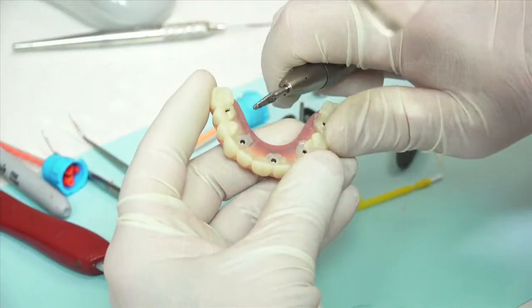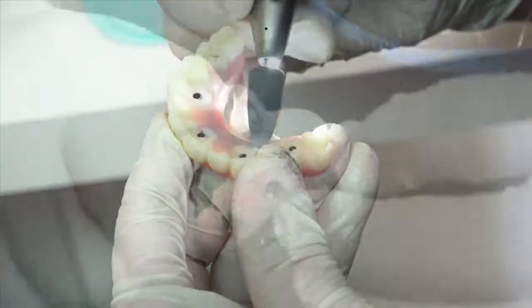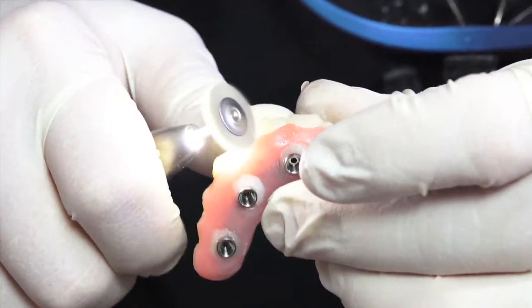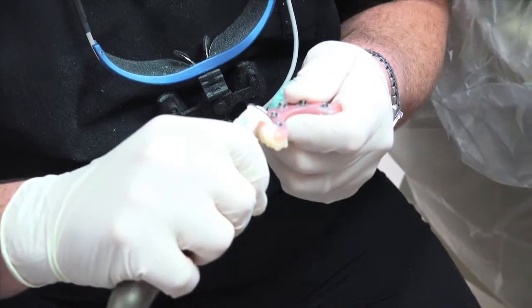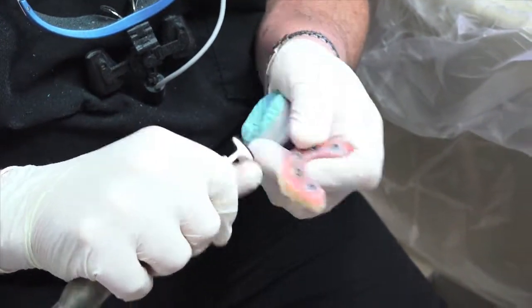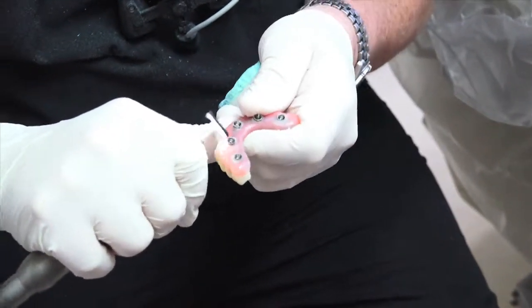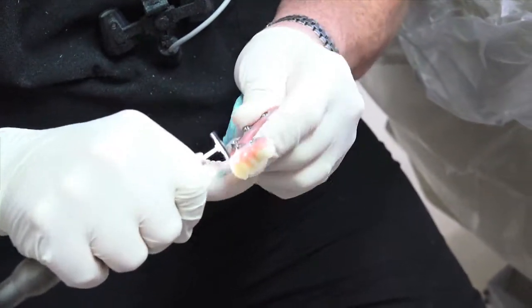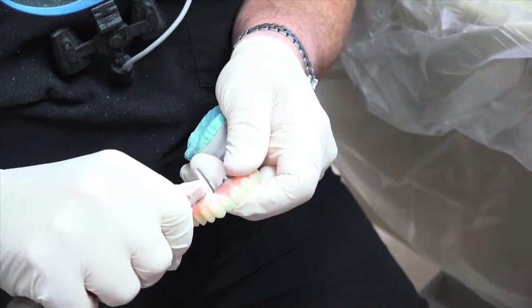If bulk reduction or additional finishing is needed, use an acrylic burr. Next, use a rubber point for final smoothing and shaping. Using a stiff bristle brush works nicely for blending the luted material to the base of the provisional and for removing any flash around the metal collars of the temporary cylinders. Moving the bristle brush in a circular motion will help to prevent cutting of the acrylic. Very often, this is all that is needed to prepare the provisional for final polishing. The long-term provisional arrives fully polished; the only areas that need to be high shined are the areas that have been added to and or modified. Using a soft bristle brush with a high shine polish compound will create a smooth and hygienic surface.